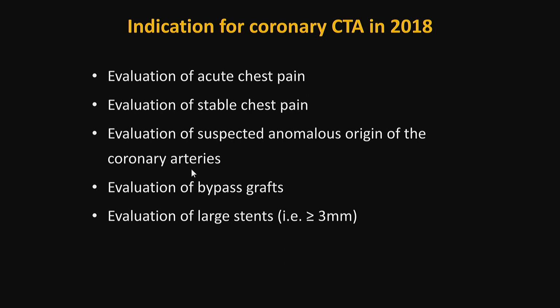Let's now turn our attention and discuss some of the indications for coronary CT angiography. They include the evaluation of both acute and stable chest pain, evaluation of patients that have suspected anomalous origin of the coronary arteries, evaluation of bypass grafts, and in some cases, evaluation of large stents. I generally would recommend 3 millimeters and above because very small stents will be more difficult to visualize.